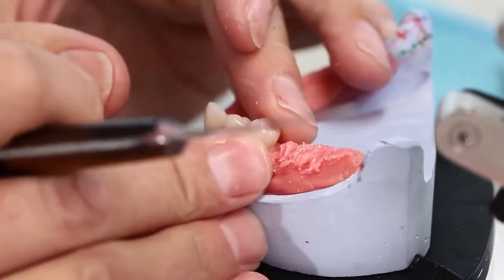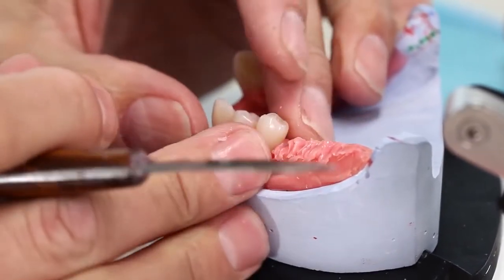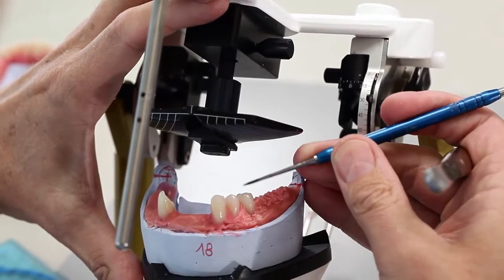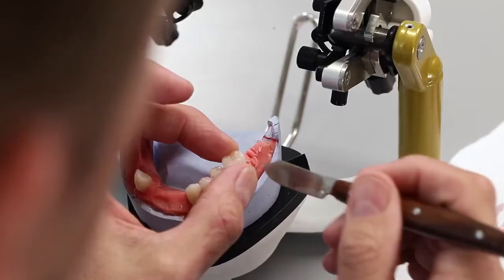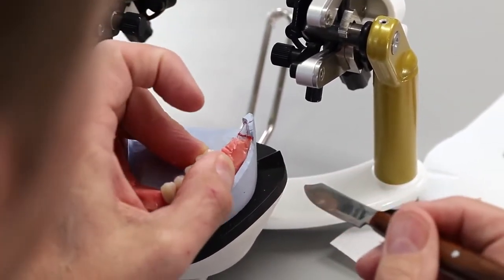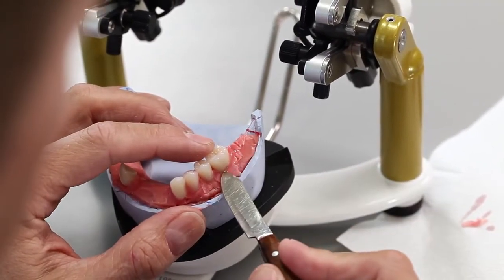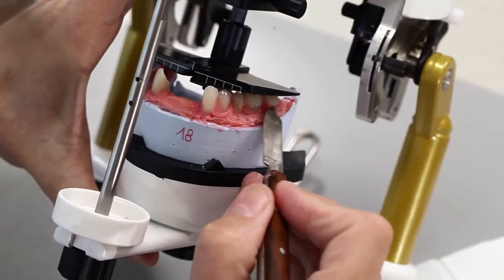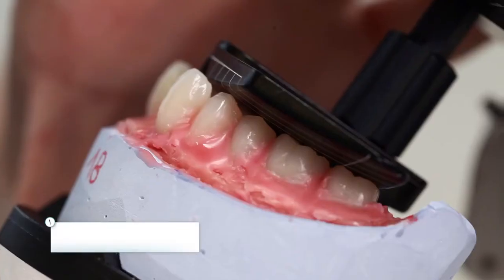Now, the mandibular type posterior teeth can be symmetrically aligned with the template on both sides. Pound's line and the center of the alveolar ridge are reference points for the orientation of the functional corridor for the posterior tooth setup. In this way, the lingual and buccal limit and the statics are taken into consideration. The posterior teeth have contacts with the template as follows.